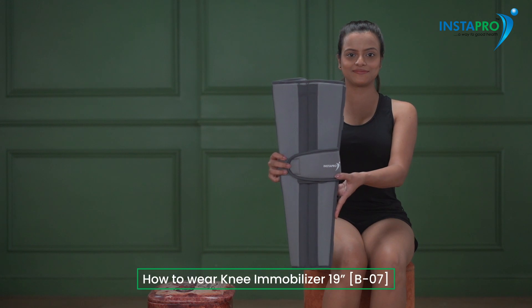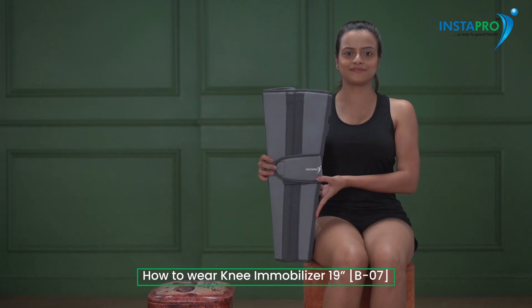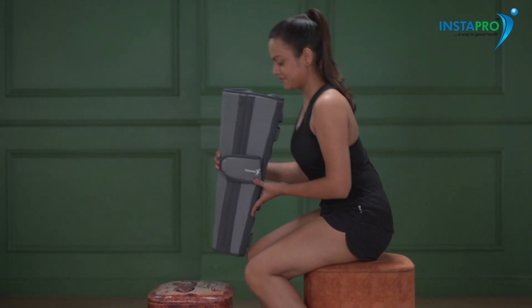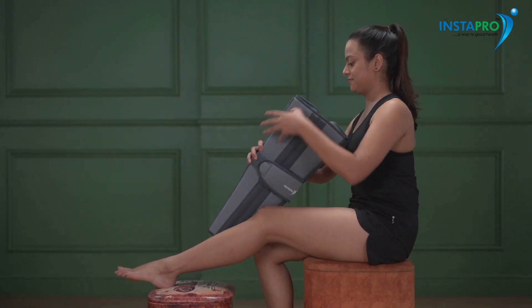Knee Immobilizer is a brace to immobilize, support and protect the injured or operated knee while it recuperates. It can be used following fractures, muscular, ligament injury and dislocations.